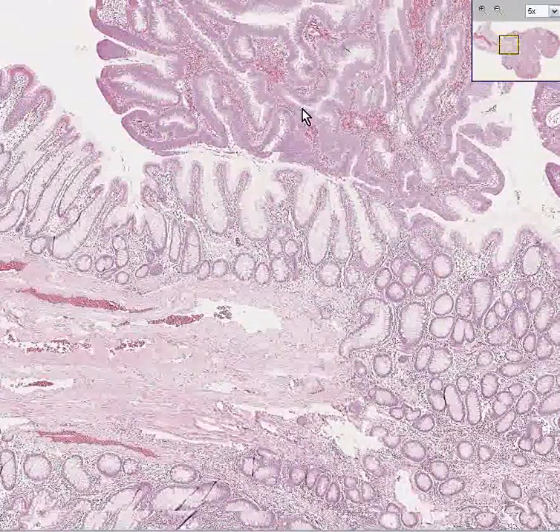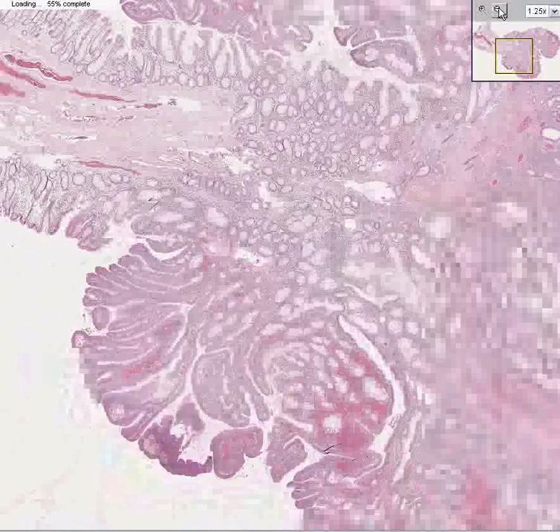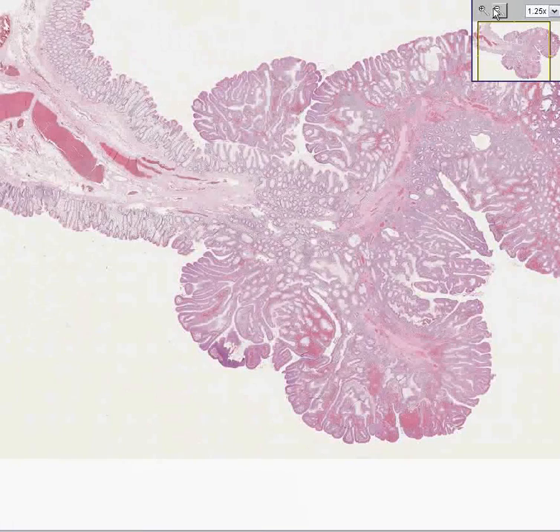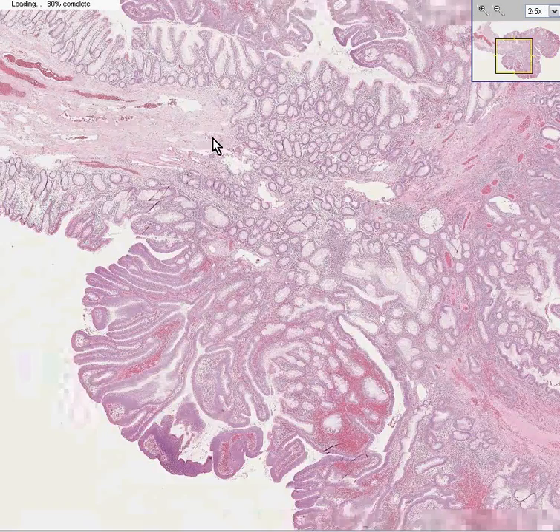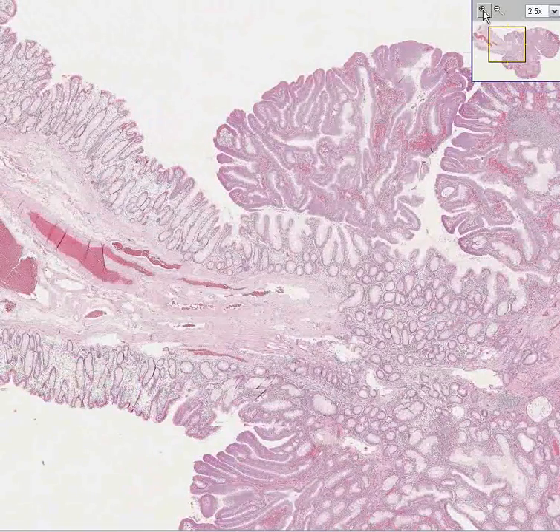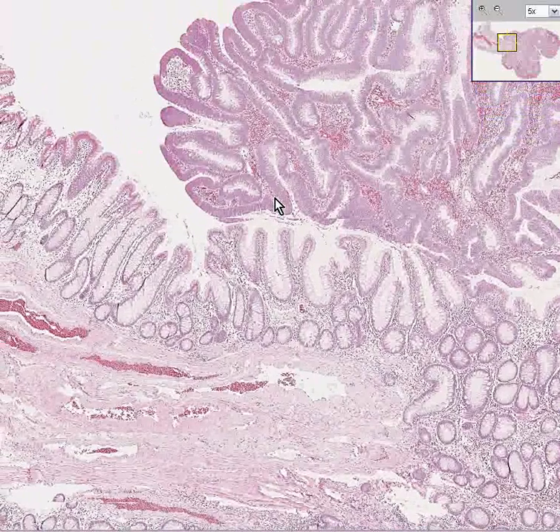But all of this area here — the rest of it — is your adenoma or your polyp in question. So let's decide whether it's a tubular adenoma, i.e. adenomatous polyp, or whether it's a hyperplastic polyp.